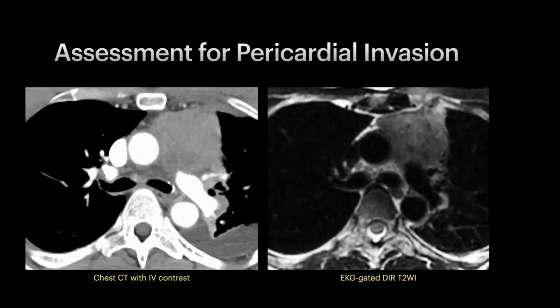Same thymic carcinoma. The surgeon also wanted to know if it was invading through pericardium. And you can see, indeed, it is invading through that black line of pericardium further into the mediastinum. Unequivocal assessment that we couldn't definitively make by CT.